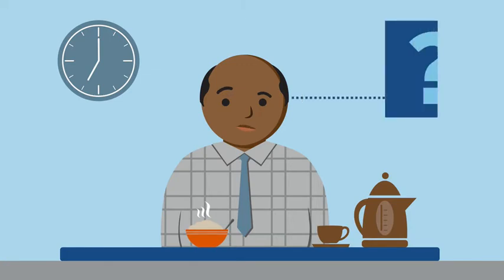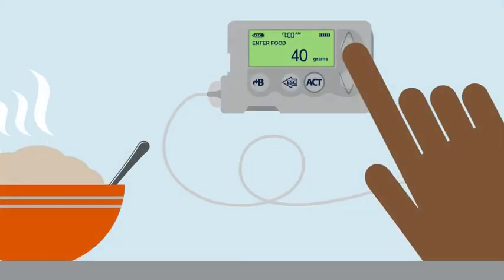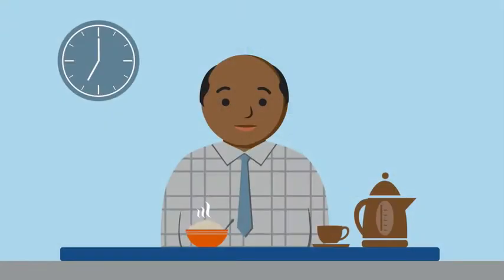Connor tries to remember what his dietician taught him about estimating carbs. He takes a guess at the number of carbs in the bowl of oatmeal and enters it in his new insulin pump. Connor's had his pump for two weeks now and is happy with how much easier it is to give insulin.